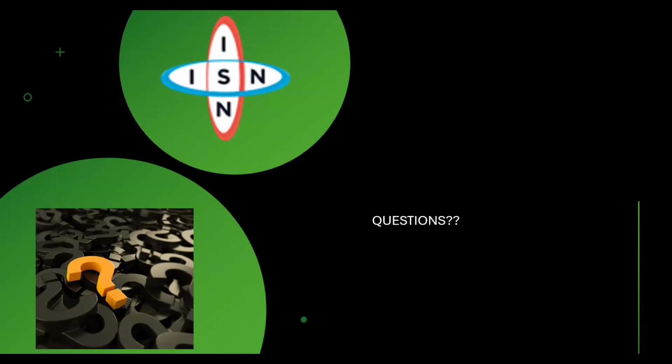So any other question, please? Someone on the chat asked, since these documentations are needed, do you provide this as installation to the machine, like post-installation calibration, post-installation control, and other relevant documents? Yes, if you ask for it, we'll give you these documentations.